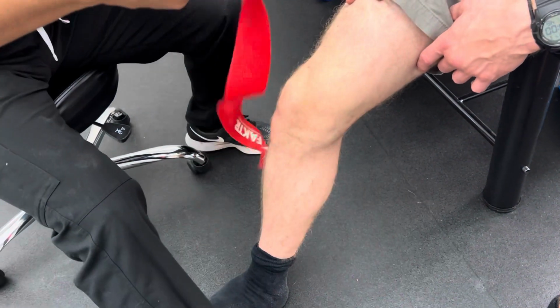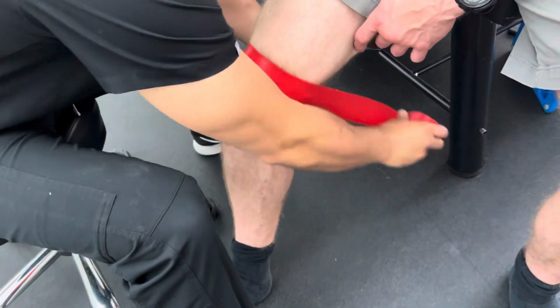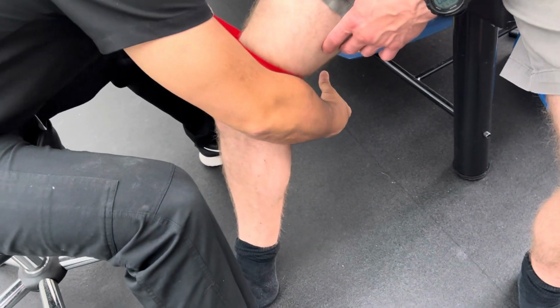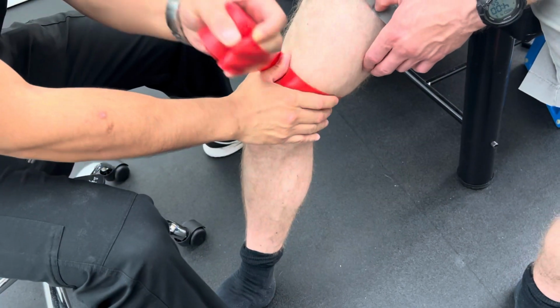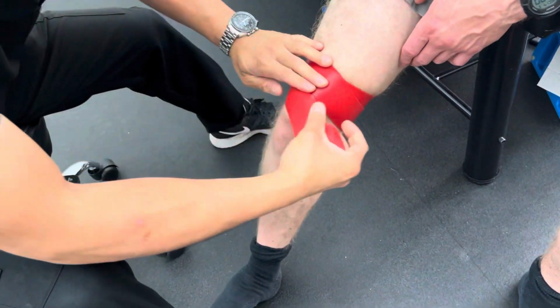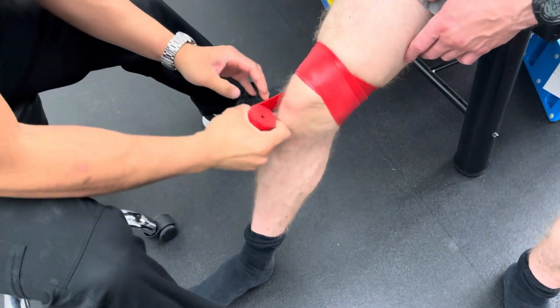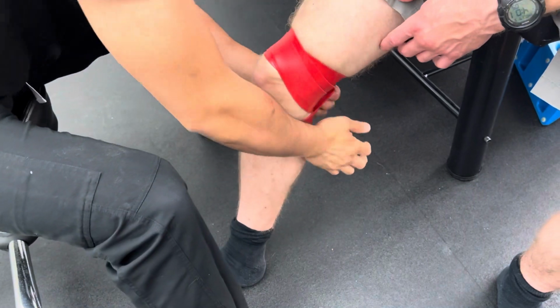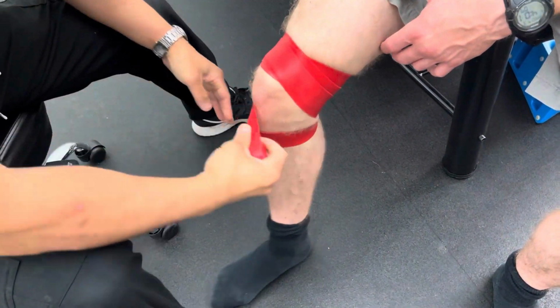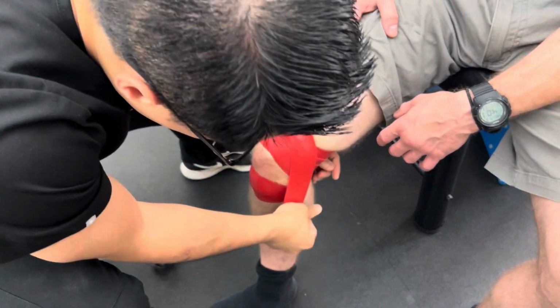A couple of things I will say is that this can be very uncomfortable on the patient or an athlete that you're working on. We also want to avoid any numbness going down into the joint itself. As you can see, I'm going around the joint itself, making it tight. You okay there, Coach? Yep. All right. So far, so good.